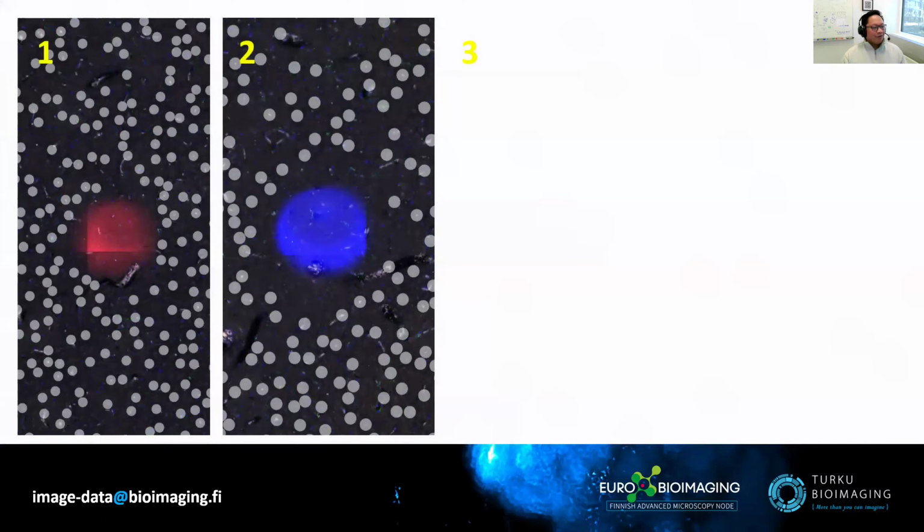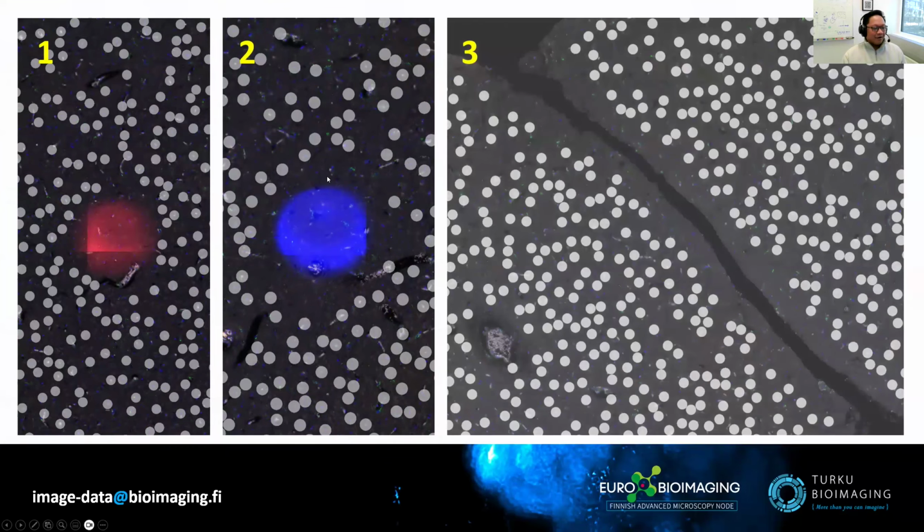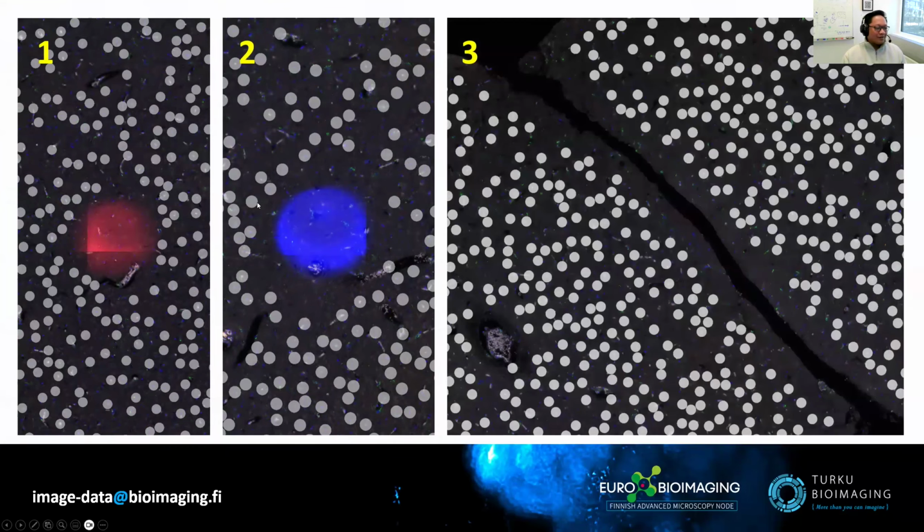And of course here, because we have already figured out the exclusion for the image artifacts, you can see that in this particular example image, there are no nuclei, the white circles, around the image artifacts. And this is all, up to this point, completely automatic. You can also see in one part that the nuclei are a certain distance away from the tissue section border.